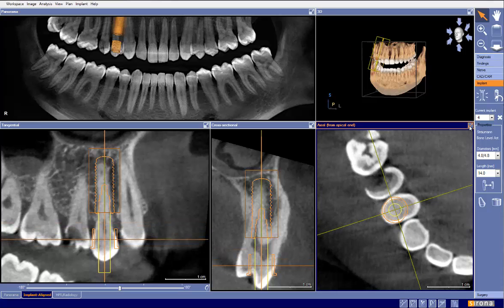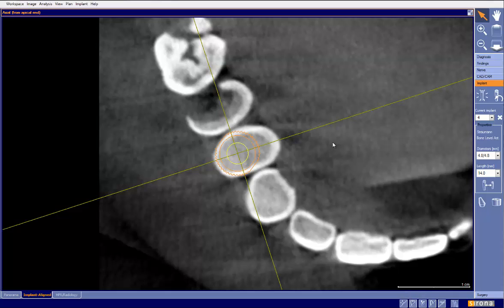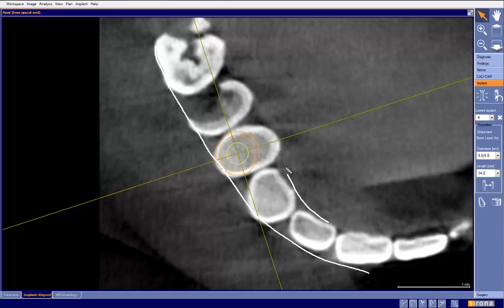And right away, one of the things I'm noticing, and what I would like to do here, is share my technique for this. What I typically do in a case like this is mentally outline lines like so, and lines like so, the mesial of the adjacent tooth, the distal of that tooth, and if we were to draw a line, we would say that we want our circle coming out right about here, and in our case we have our circle coming out right there.